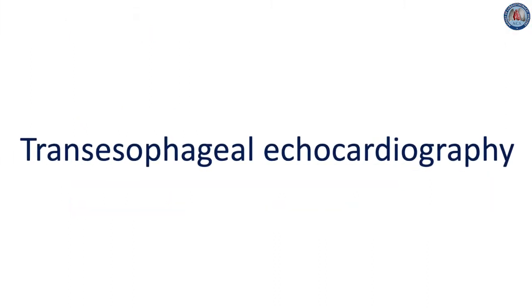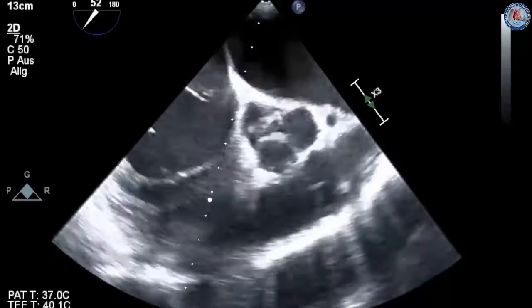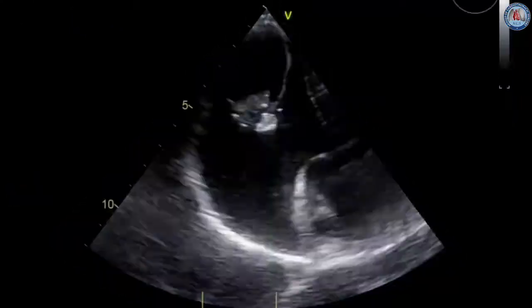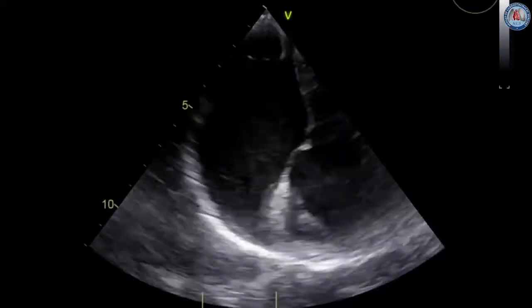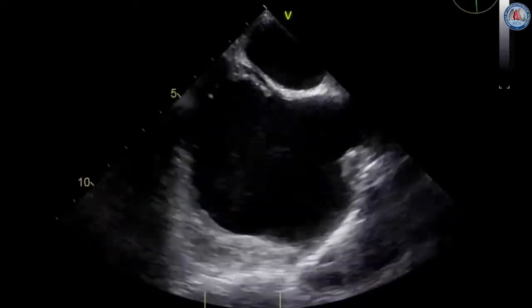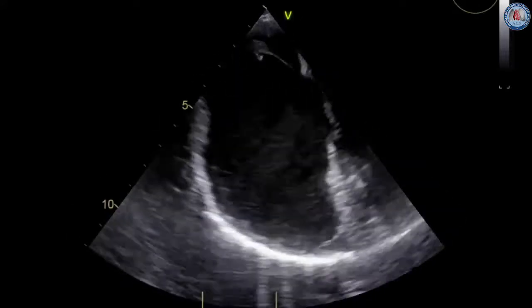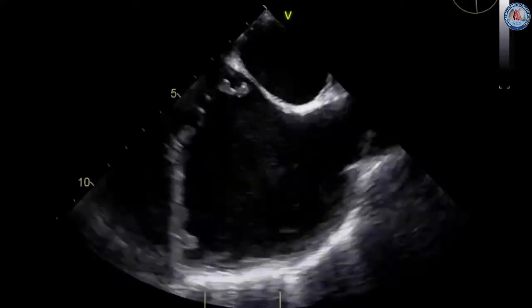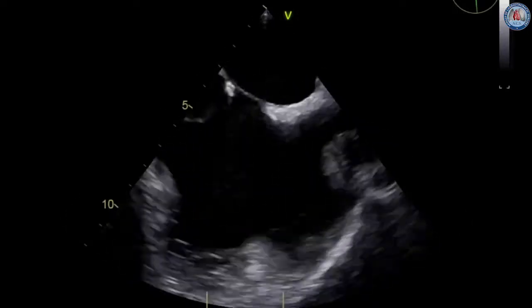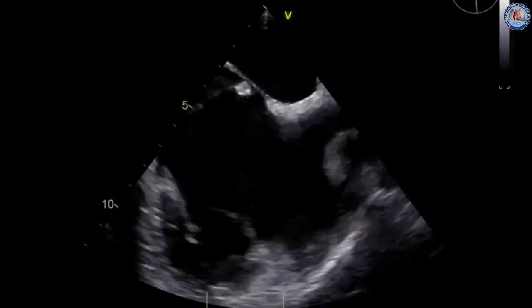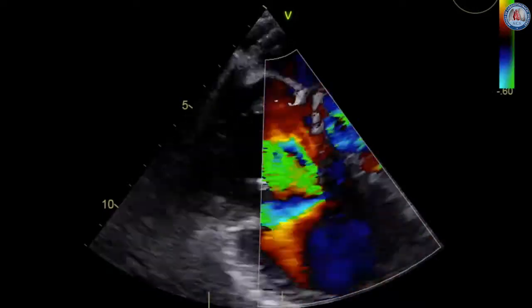Transesophageal echocardiography evidences vegetations on the aortic valve and a severe aortic regurgitation. Additionally, a mobile structure arising from the eustachian valve of the inferior vena cava, as well as a severe tricuspid regurgitation, are observed.